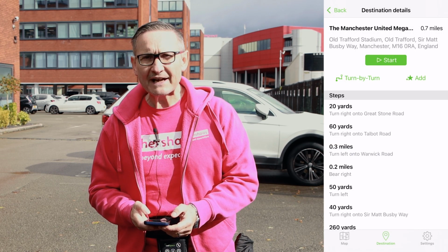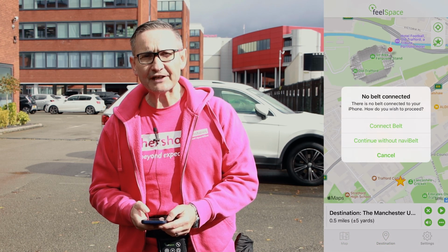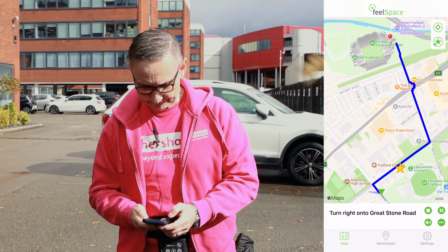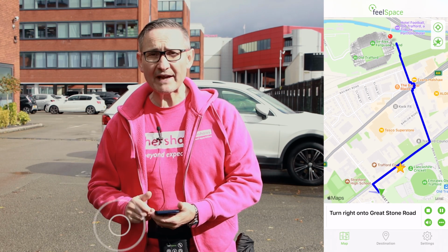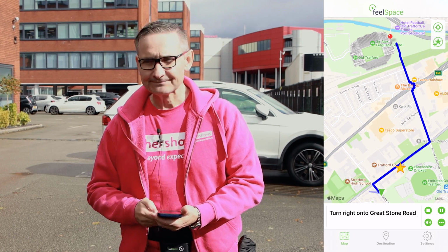I'm going to go turn by turn. I'm going to press start and connect the belt. Turn right onto Great Stone Road. And the belt's now telling me to head that way. So that's the way I'm going to go. So I'll see you on the trip.